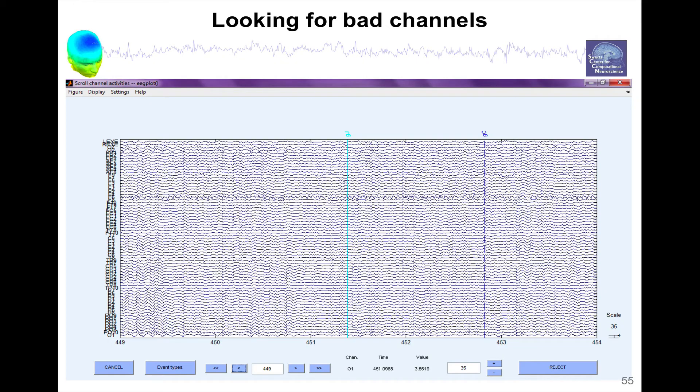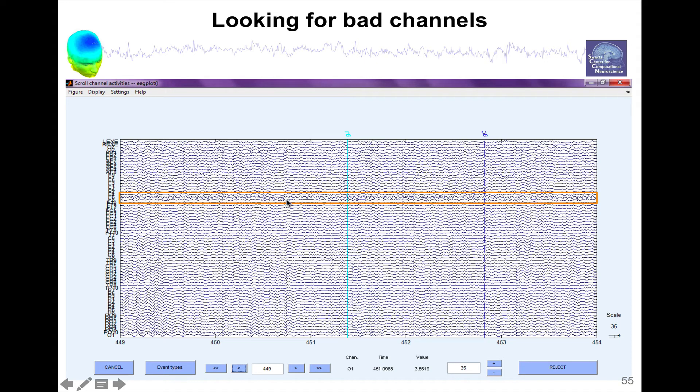So the other thing you might want to do is to look for bad channels. So here for instance we can see this channel is probably a bad channel. So it is very important to look at your data. That's one of the key steps.